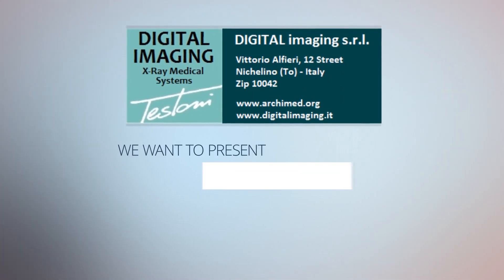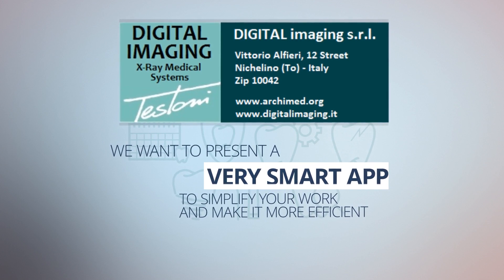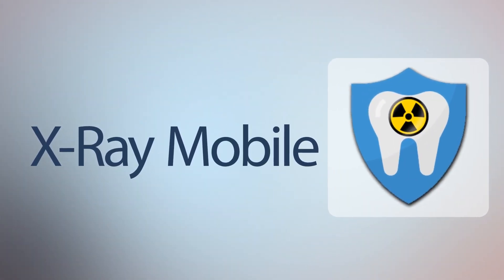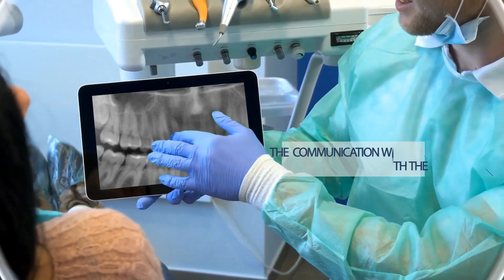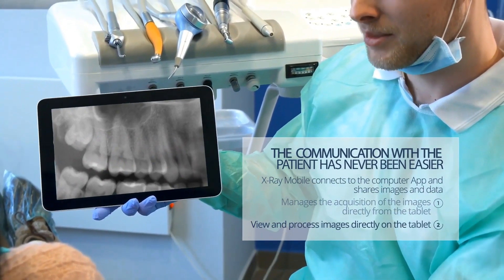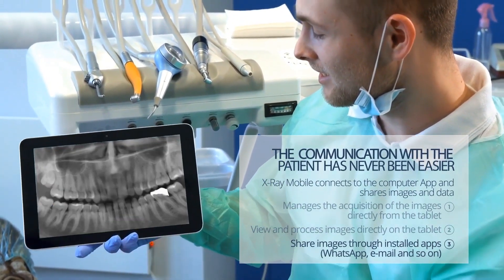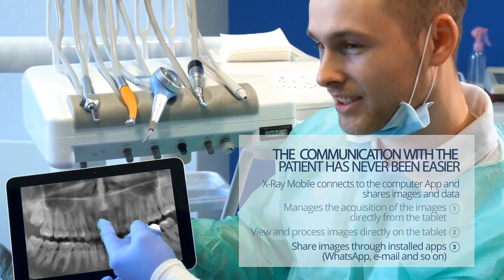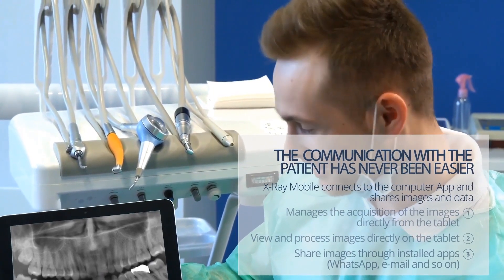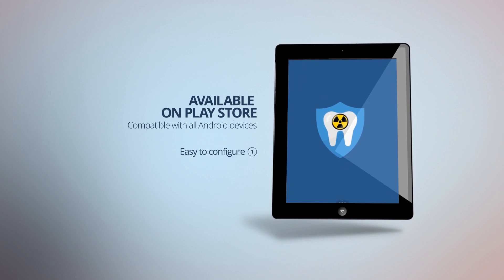In digital imaging, we want to present a very smart app to simplify your work and make it more efficient. X-Ray Mobile — the communication with the patient has never been easier. X-Ray Mobile connects to the computer app and shares images and data, manages the acquisition of images directly from the tablet, views and processes images directly on the tablet, and shares images through installed apps like WhatsApp, email, and so on. Available on the Play Store, compatible with all Android devices.